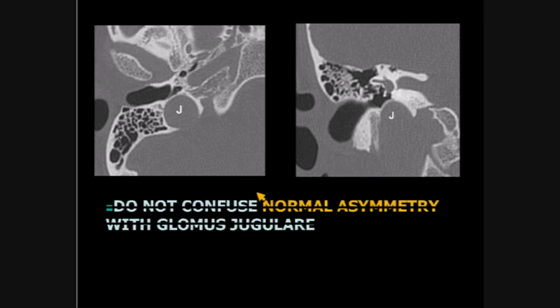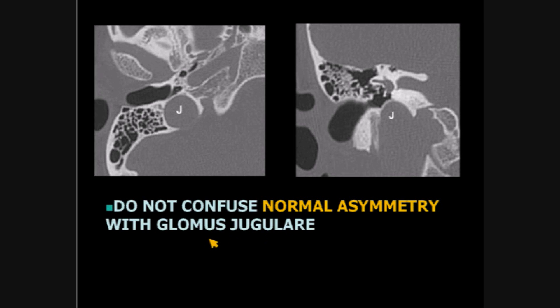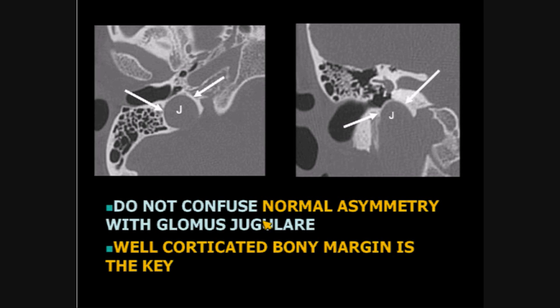This is another patient. Do not confuse the normal asymmetry with the glomus jugulari. The key is the well-corticated bony margin.